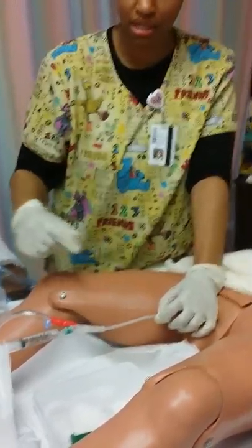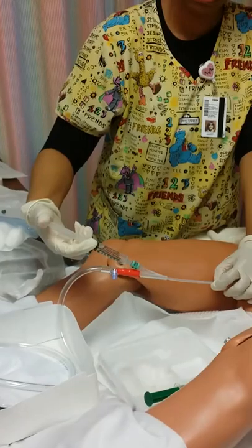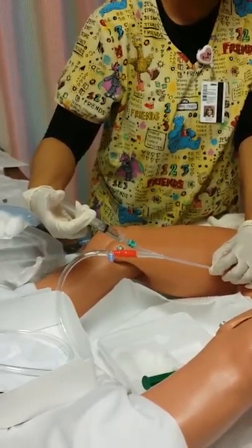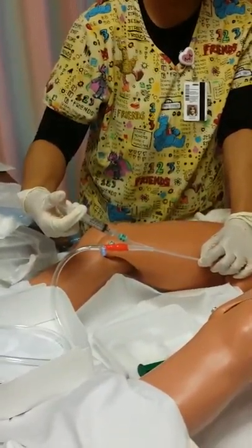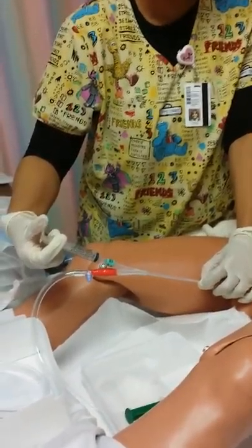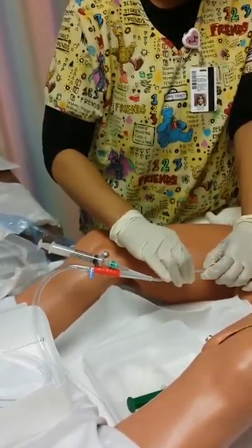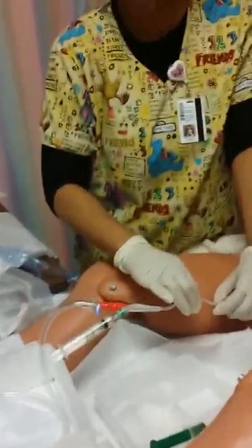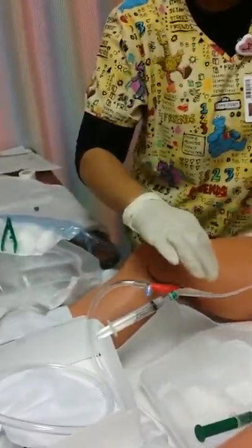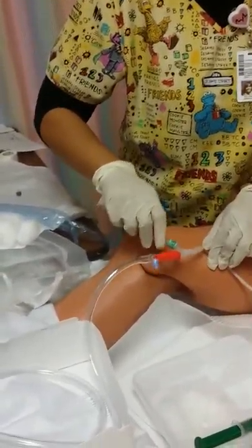And then I'm going to secure it with my non-dominant hand. And I'm going to go ahead and take this hand and push the sterile saline in to blow the balloon up on the inside so we can secure the catheter so it won't come out. Okay, so that's done. So then I will go ahead and pull it to see if it's secure, and it is. Okay. So I'll go ahead and secure the catheter to the side and take this off as well.